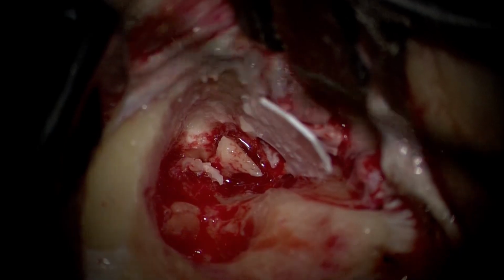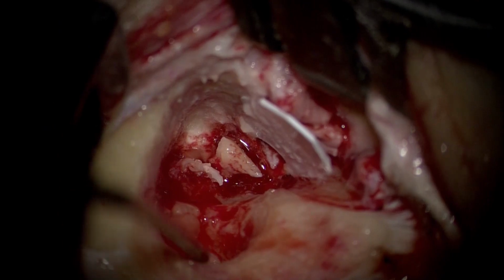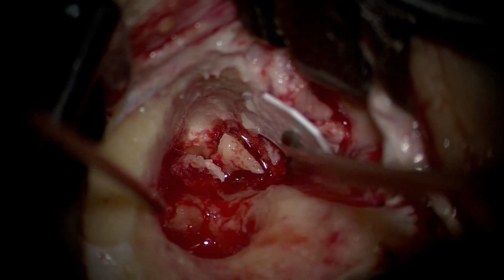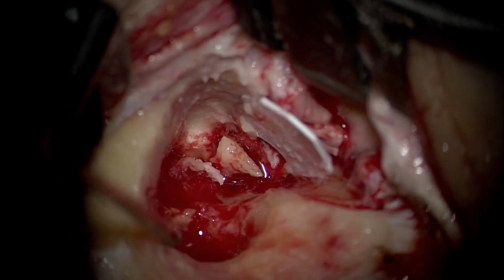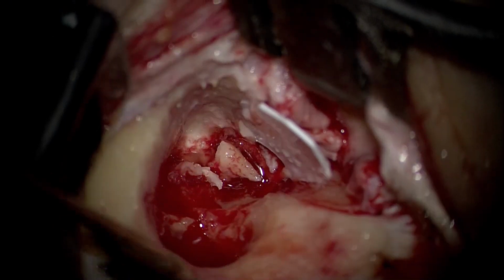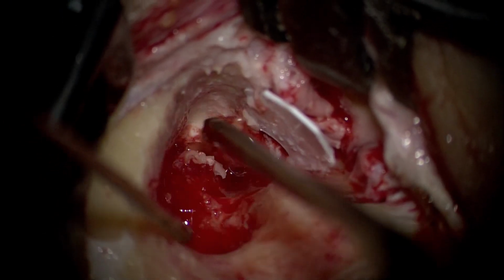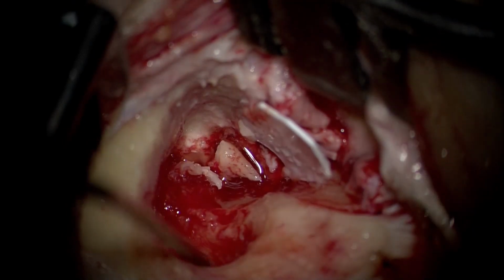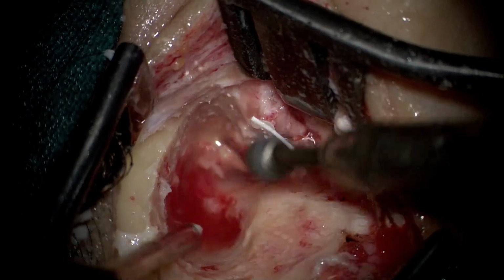It is a usual practice to send this edematous mucosa both for histopathology as well as for tissue cultures, because often these patients have been on antibiotics and pus cultures alone may not reveal the offending organism. Finding the right organism and the right antibiotic sensitivity goes a long way in ensuring optimal outcomes in these patients. So part of the tissue goes for histopathology, part of it goes for tissue culture, and that is separate from the actual cholesteatoma sac that we remove.